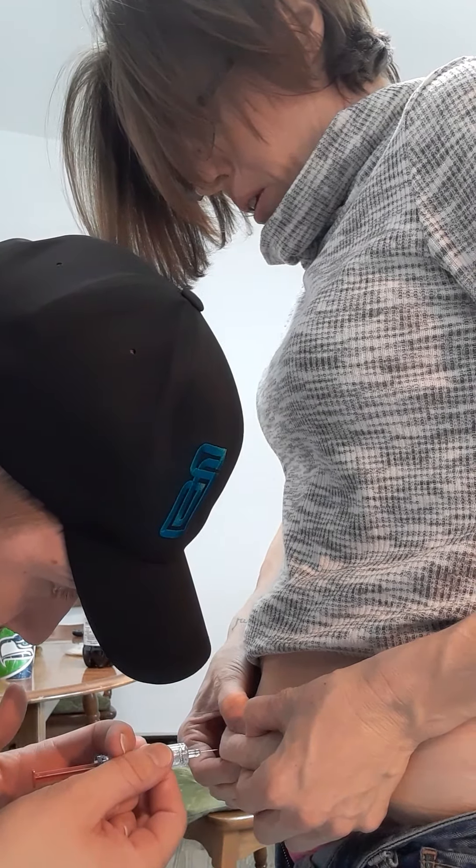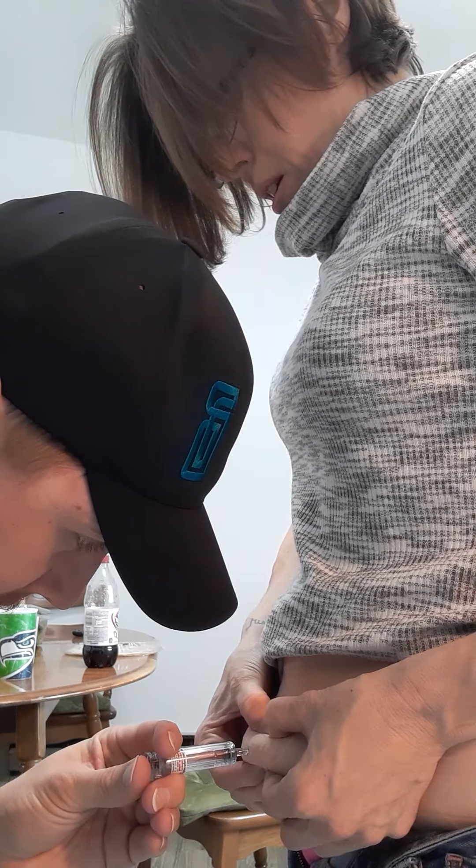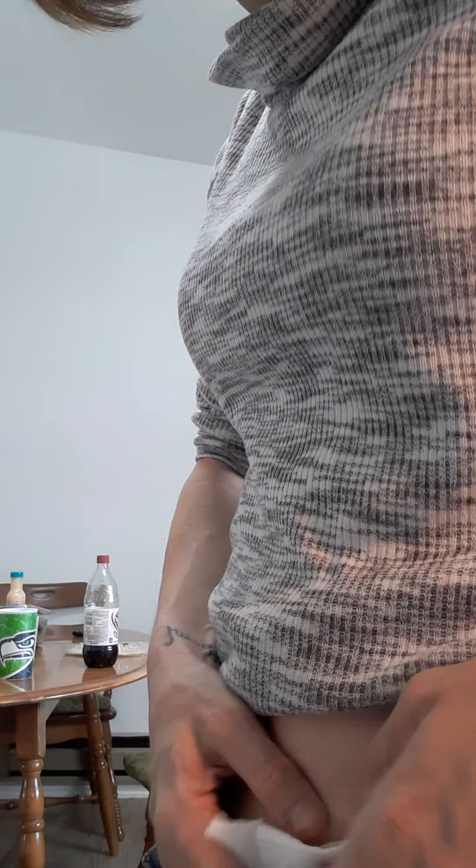Lord have mercy! And then you hold it when you pull it out. And you sometimes will bleed, which I did a little bit — just a little. But it's okay.